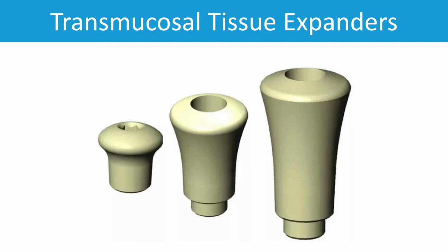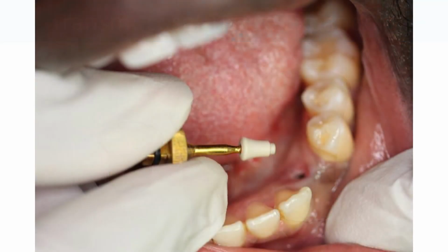Sometimes you need to fit a denture back in, and in order to do that you can actually cut away the plastic. This is better than cutting away at the denture because you could affect the fit of the denture, which again would upset the patient that you've unnecessarily trimmed their denture. So by trimming the abutment there can be no complaints from the patient.